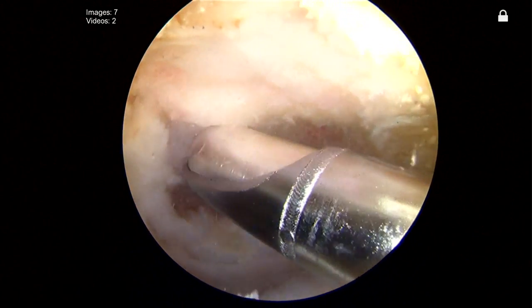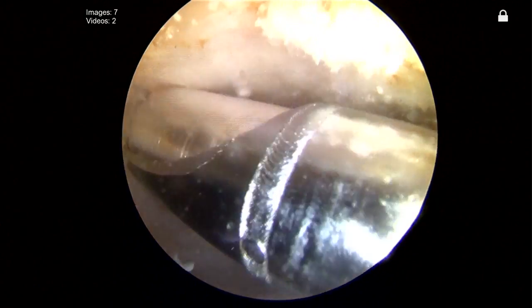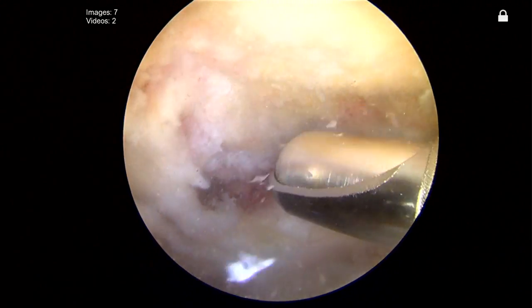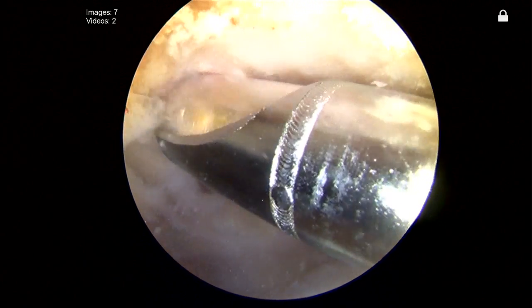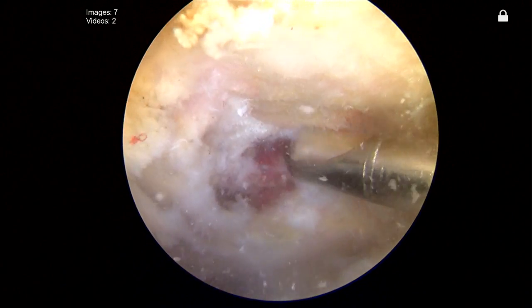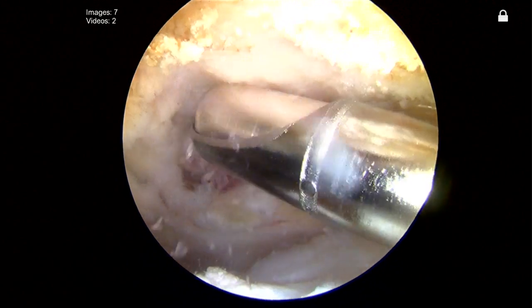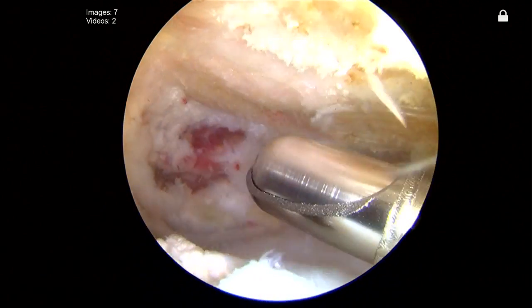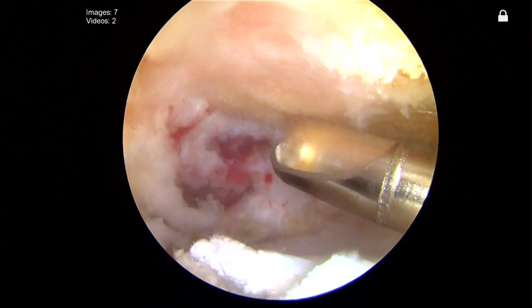We're going to start by doing a limited acromioplasty — we've already started this but we'll show you how we finish it. We're basically using a cutting block technique. I'm looking from the side to evaluate where the acromion is really flat and then taking all of the remaining bone to co-plane the acromion to make it flat from front to back. The key here is also to remember that the lateral downslope or the critical angle laterally has been associated with increased risk of rotator cuff issues. So I'm very careful to dissect the entire lateral border of the acromion to ensure I've done a complete acromioplasty with no lateral downslope remaining.